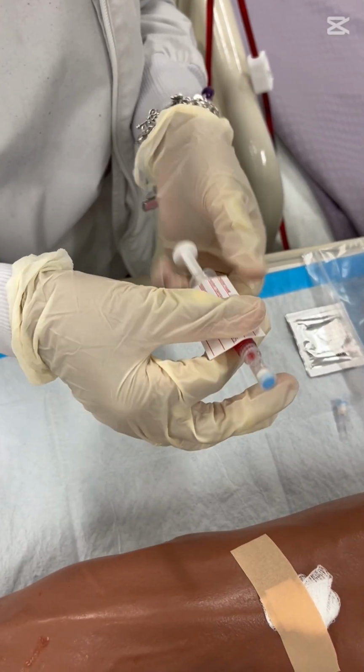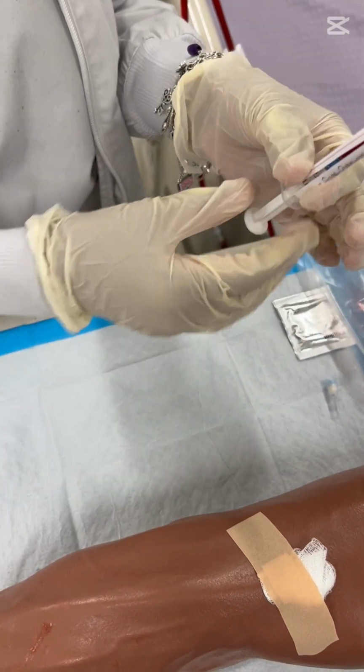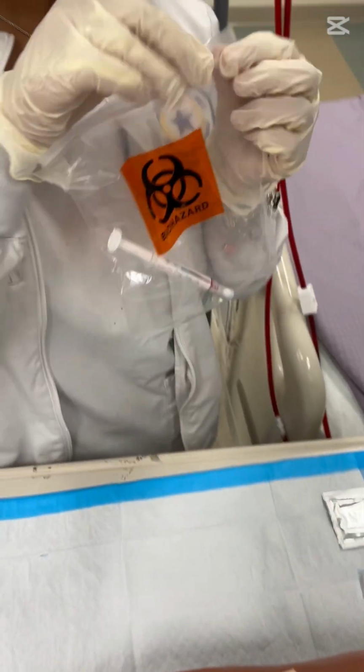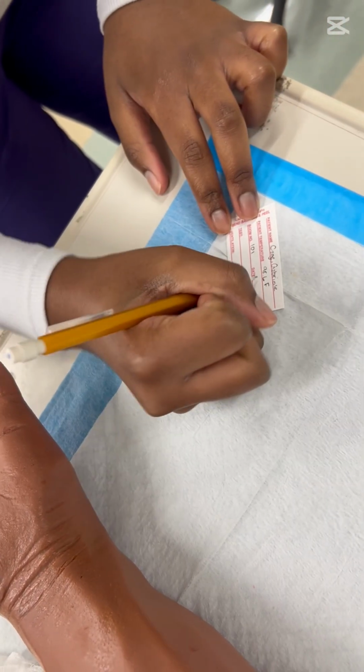Some general tips or things to know when doing this is that you do not want to use a tourniquet because this can lead to an excessive risk of bleeding, also a hematoma, or even a thrombus or an embolism. You also want to make sure that you push out any air bubbles from the syringe.